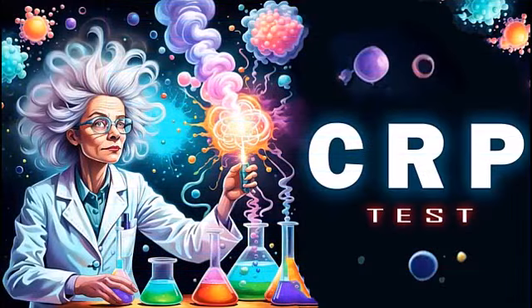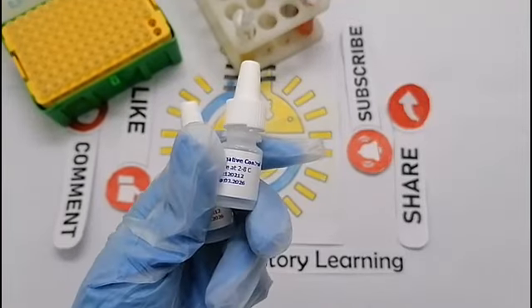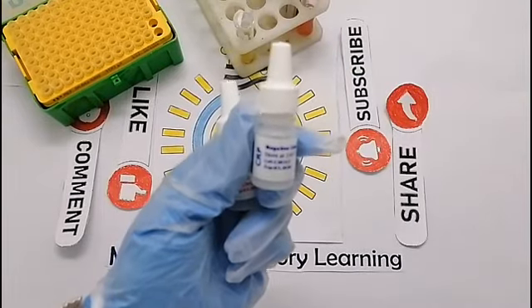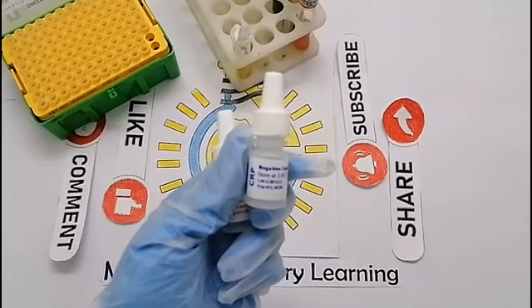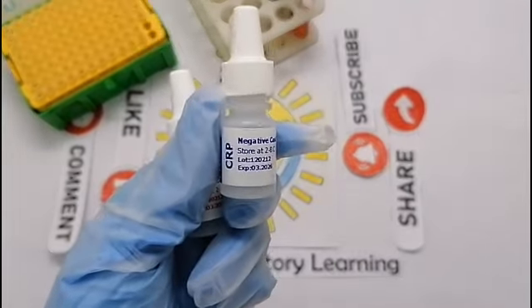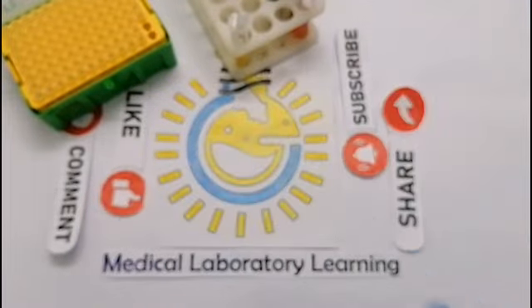How is the CRP test performed? Hey guys, it is Medical Laboratory Learning. Today, we want to run the CRP test. When we open the kit box, we see two control solutions inside, a positive control and a negative control. These controls are used to ensure the kit is working properly.